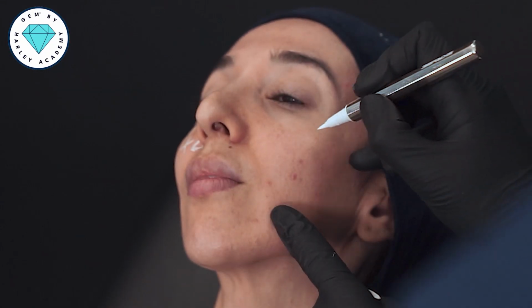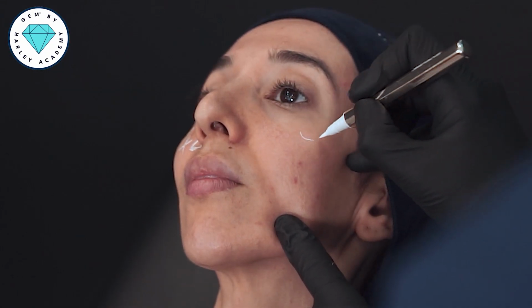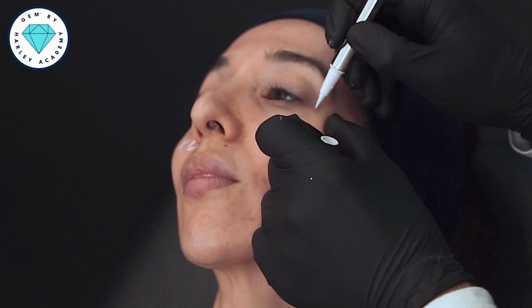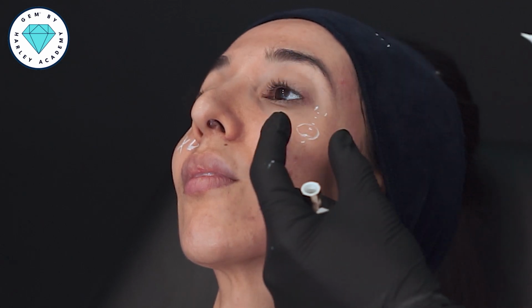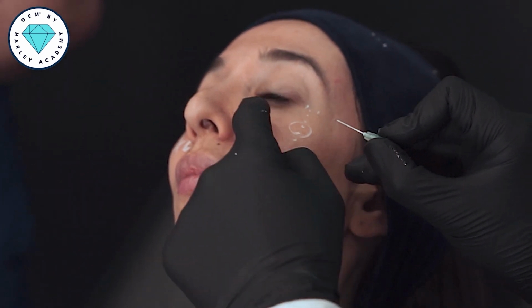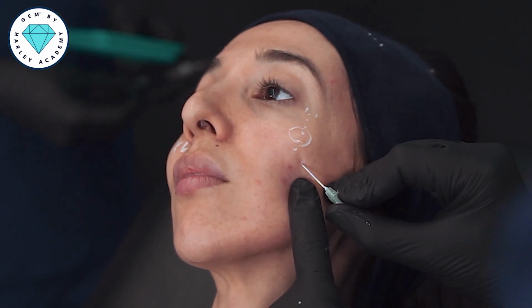So I'm just going to mark on where I want this apex of the cheek to live. Again, it's this intersection between this lateral bony orbit here. I'd like to draw a vertical line down here. And this will vary depending on masculine or feminine preferences. But this is where I tend to find the point of most projection that I want to achieve. And I'm going to make an entry point that allows me to treat this apex and also continue into the tear trough. So it's going to come in this direction.